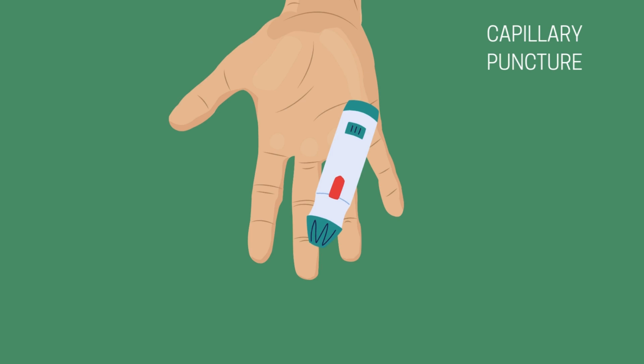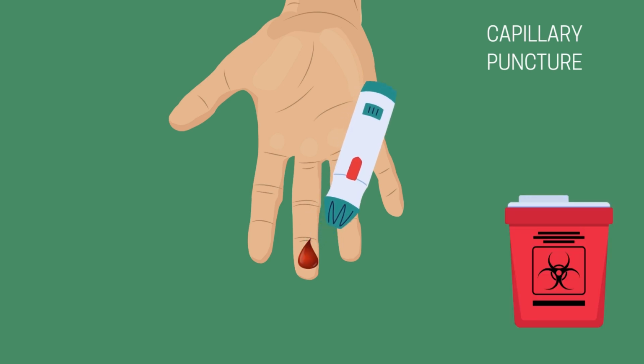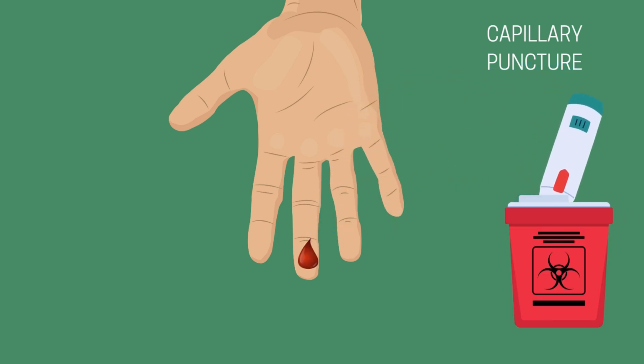Press the lancet down. Most will make a sound to indicate that the needle inside has deployed. Make sure that you dispose of the lancet immediately into the sharps container that is within arm's reach, and never set the lancet down for later disposal. Using a piece of gauze, wipe away the first drop of blood, as it will contain a higher level of tissue fluid and make the test inaccurate.